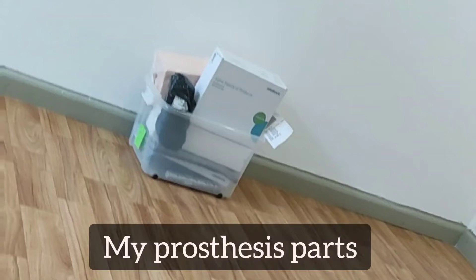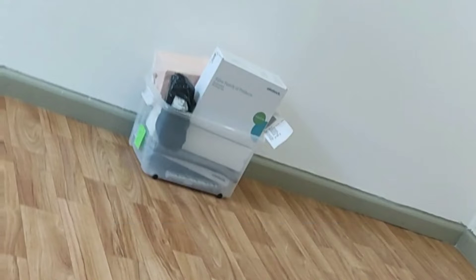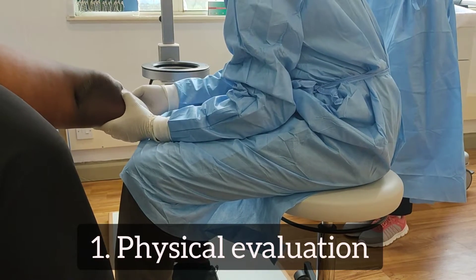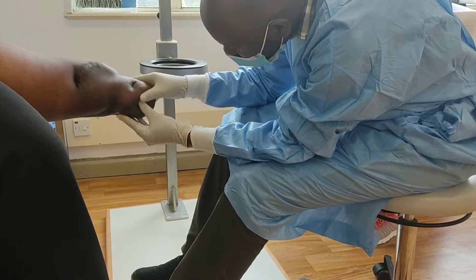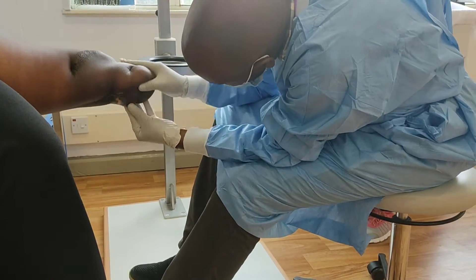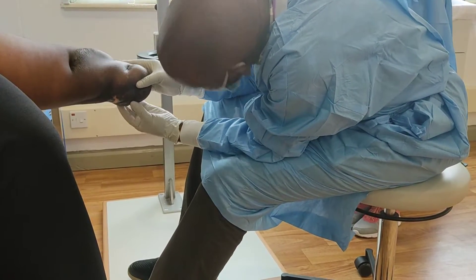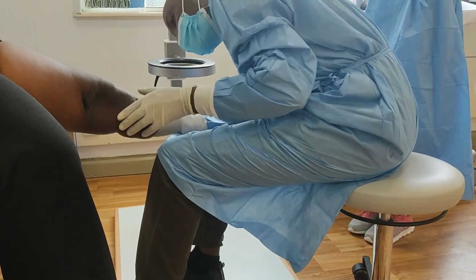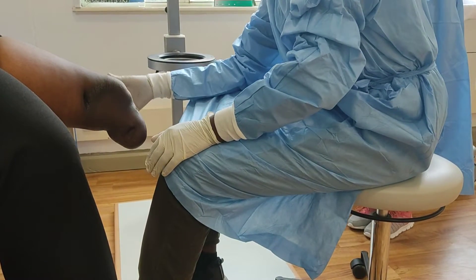So I got my prosthesis from Ottawa, Kenya after I've paid and my parts have been ordered from Germany. It starts with physical evaluation and checking whether you are fit enough to use a prosthesis. If you're not, you have to wait a while, and if you are, they will try to check which type of prosthesis you can use.